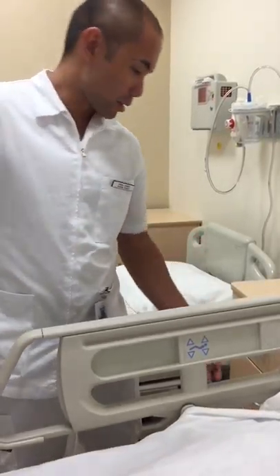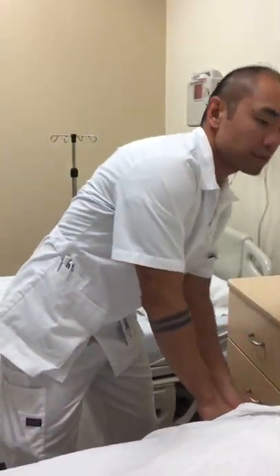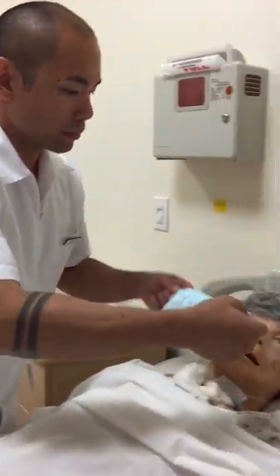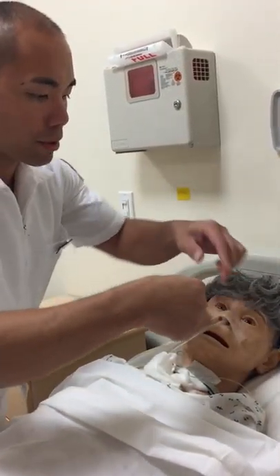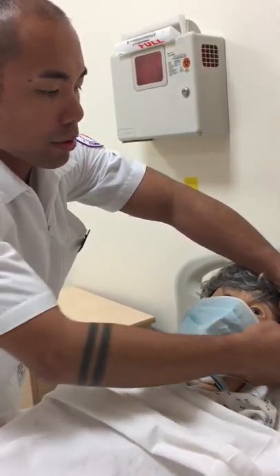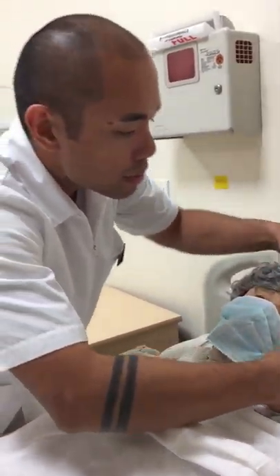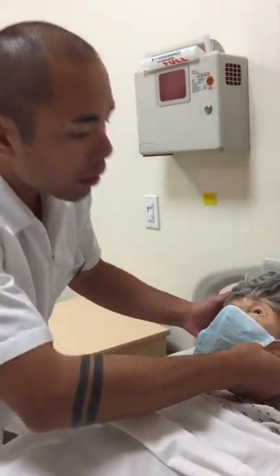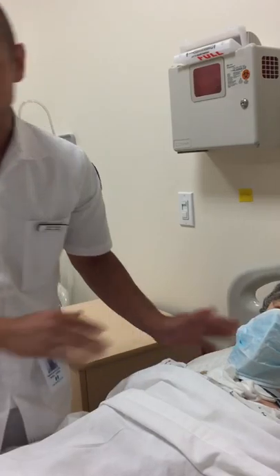I'm going to raise the table to my working height, drop the arm rail, and go ahead and put on his mask. If there was no mask available, I would ask him to turn his head away from where the central line is inserted. There you go — comfortable? Okay, good.